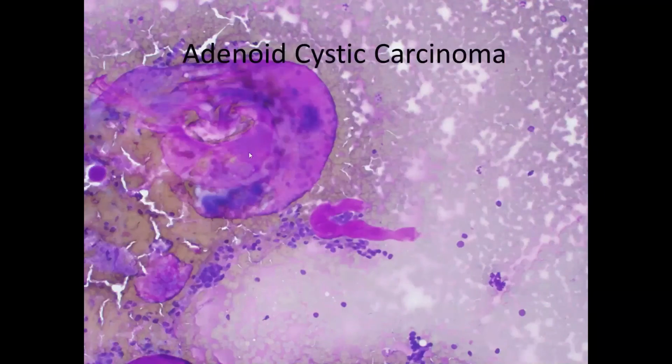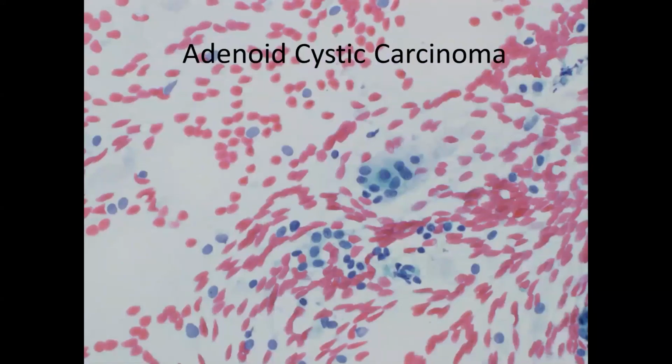Again, these more irregular stromal fragments are another sort of clue in addition to those gumballs that we talked about a few minutes ago. And again, key thing, the individual cells in an adenoid cystic carcinoma are not overtly malignant or pleomorphic or anything like that. They're very bland and very monotonous. The key to this diagnosis is recognizing the overall pattern, because if you looked at the individual cells in a vacuum, there's no way you could really identify this as being a high-grade malignancy that necessitates a very aggressive surgical approach. So the overall picture is what's important.